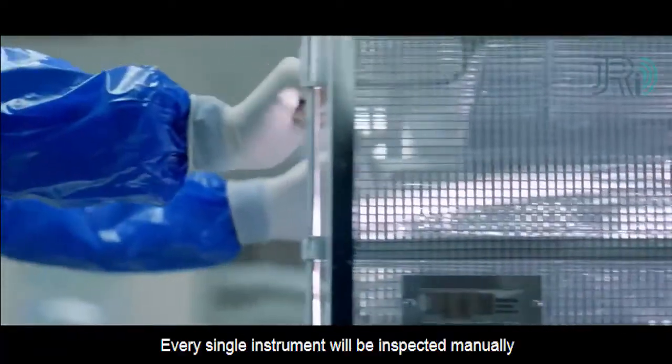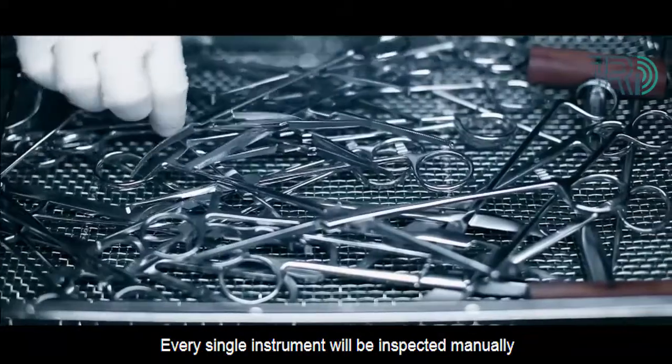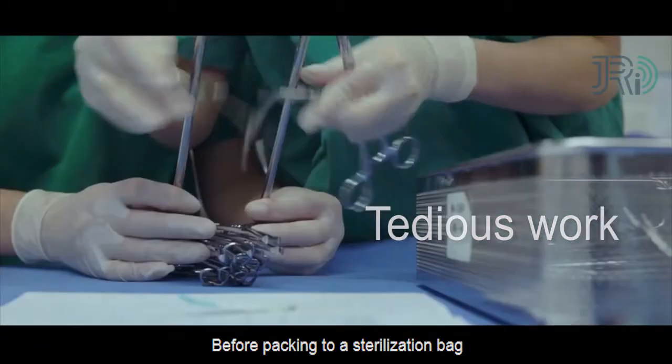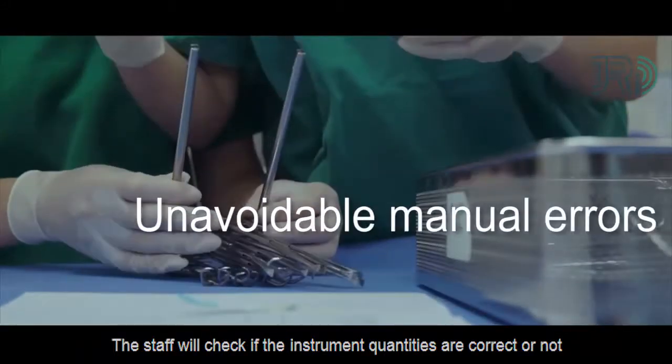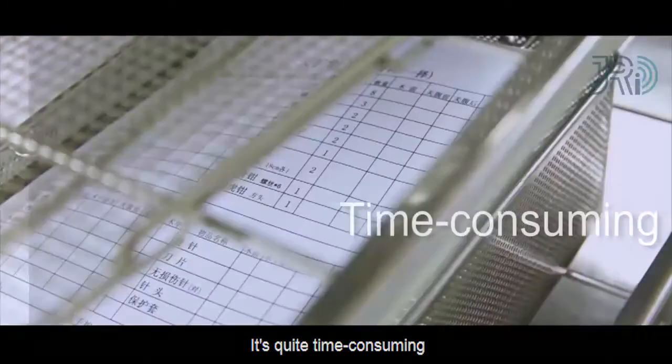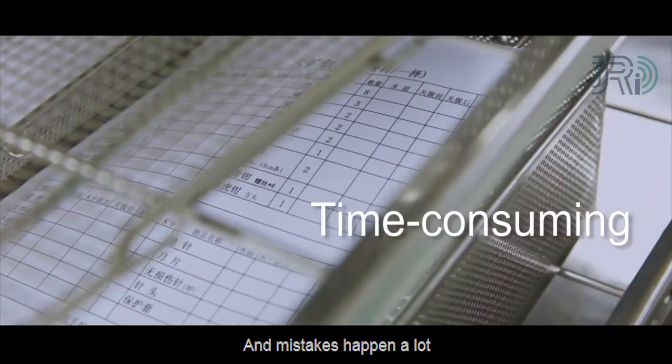Before sterilization, every single instrument will be inspected manually. Before packing into a sterilization bag, the staff will check if the instrument quantities are correct. It's quite time-consuming and mistakes happen a lot.